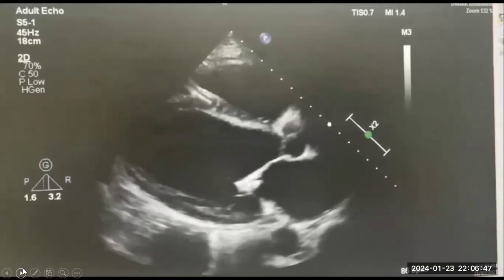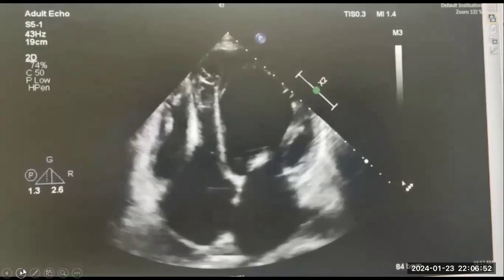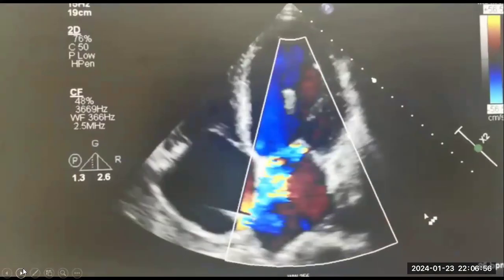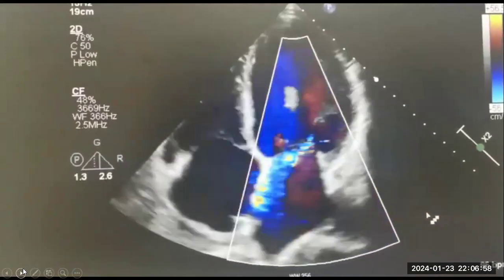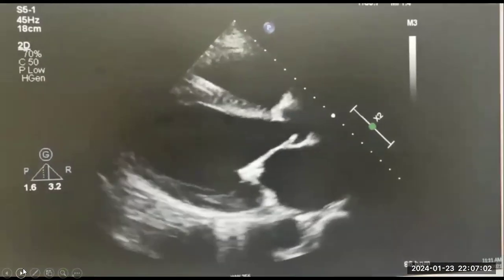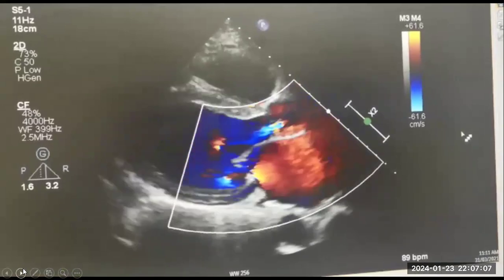Okay, let's go, guys, planning for intervention. A lot of findings in this. I can take it. And there is one extra point if you can pick it. Yeah, go ahead. Who is with me? Abdulaziz. Go ahead, Abdulaziz.